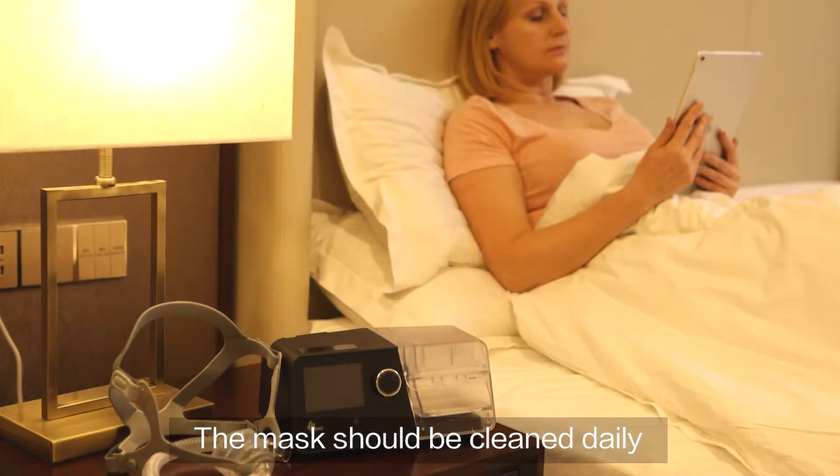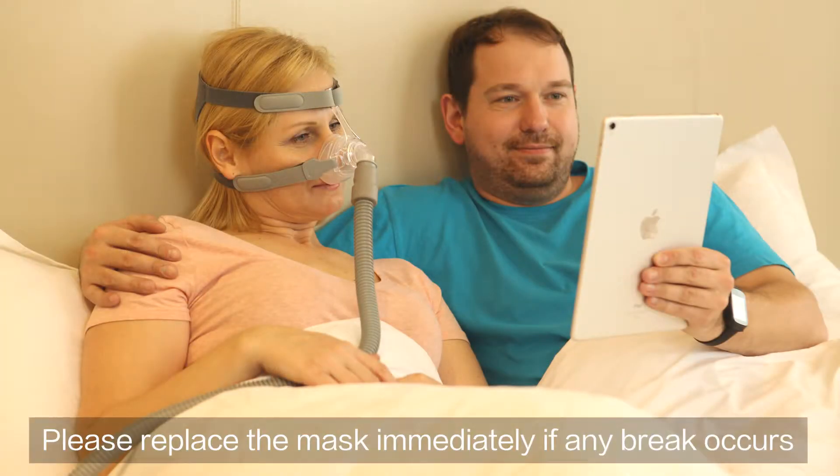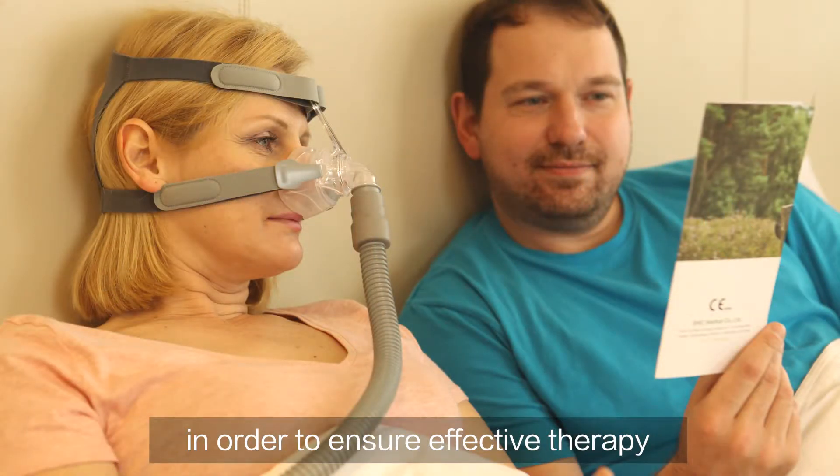The mask should be cleaned daily and replaced every 6 months. Please replace the mask immediately if any break occurs in order to ensure effective therapy.